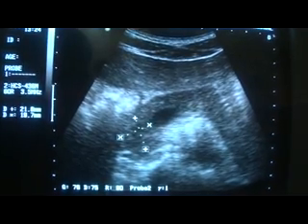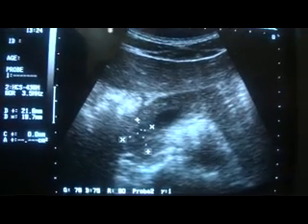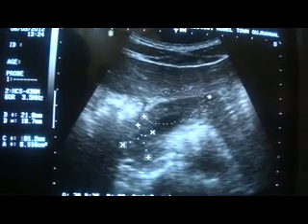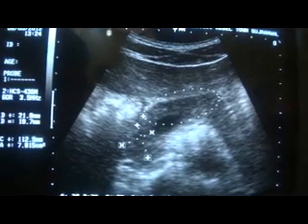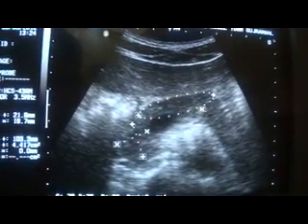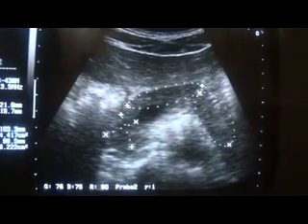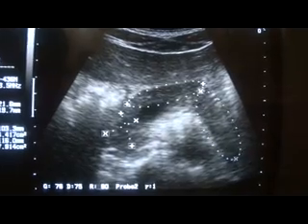This is the left gastric artery or hepatic artery that is arising from the celiac axis. The two vessels arise from the celiac trunk or celiac axis. This is to be remembered, not to confuse the splenic artery with the splenic vein while you are studying the pancreas.